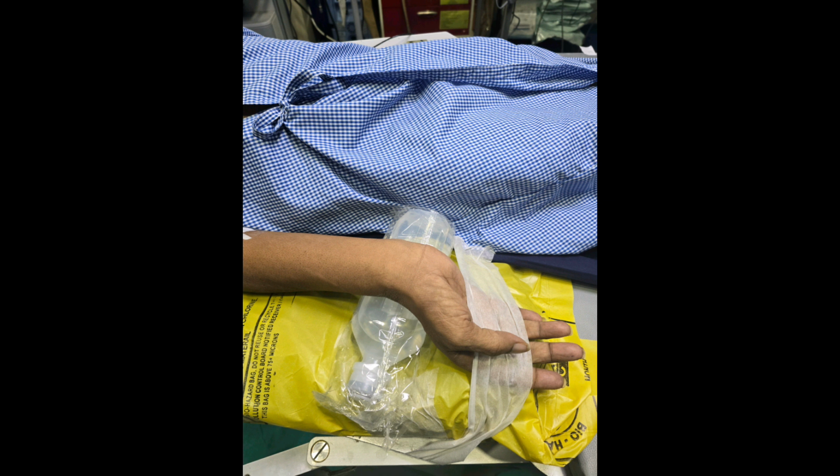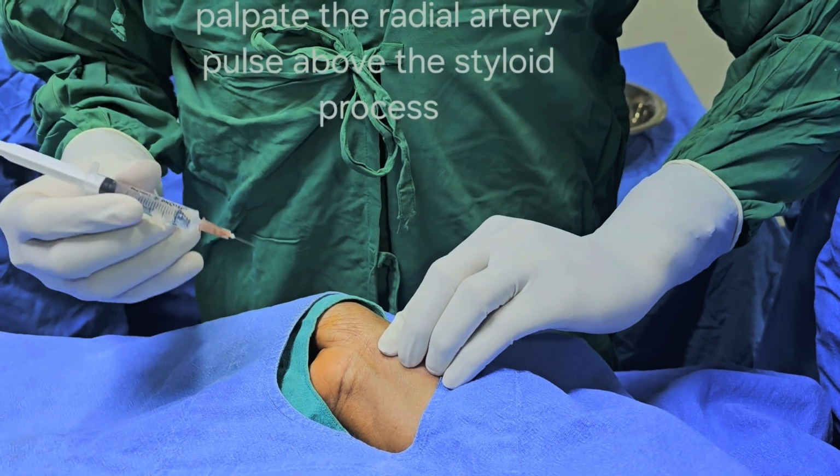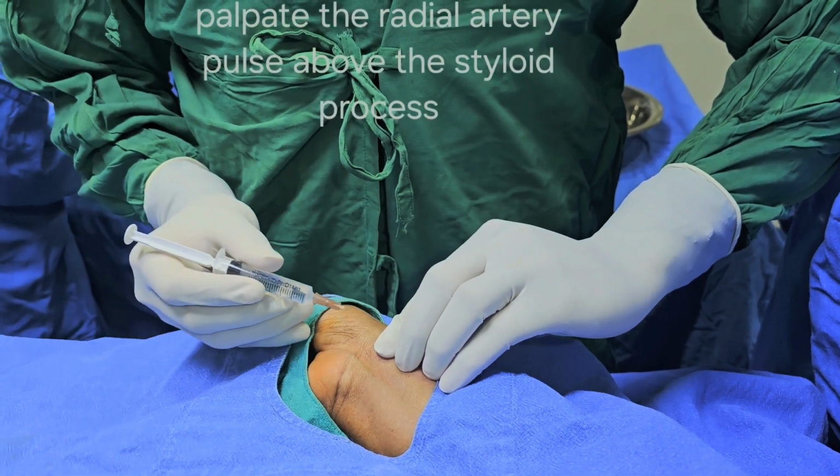Extend and stabilize the patient's right hand as shown. This is very important to give access to the radial artery. I have slowed down the video so that each step can be demonstrated clearly.